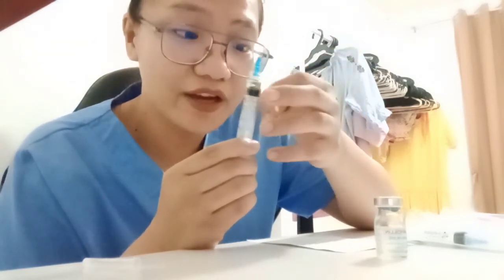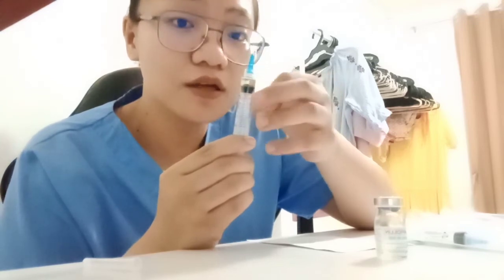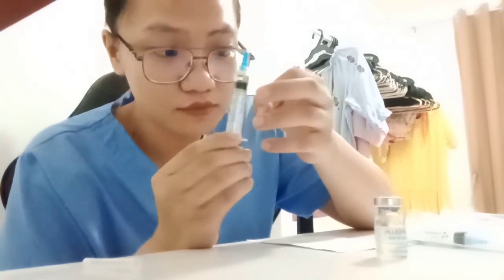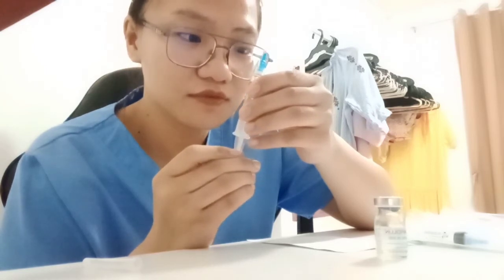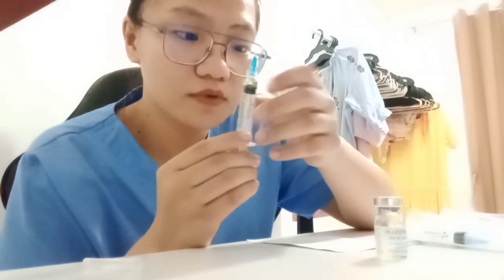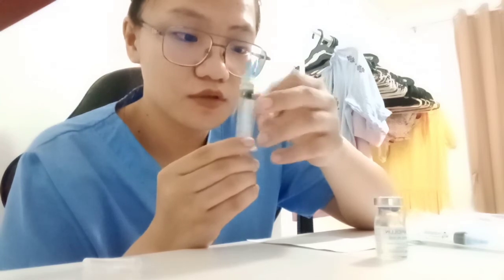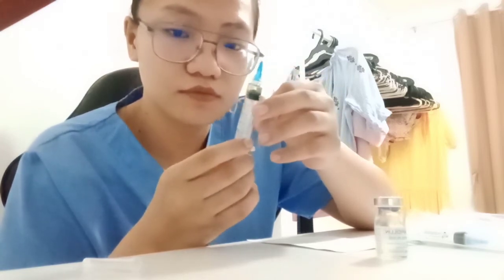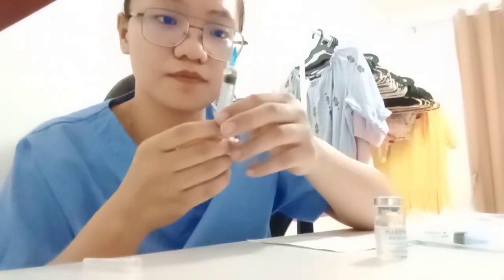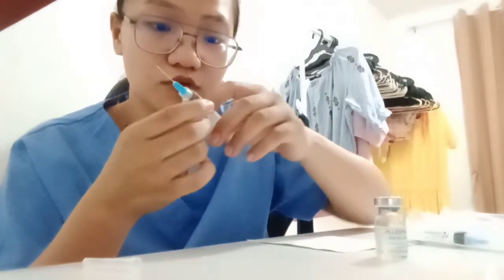If necessary, tap the syringe and pull the plunger to remove some air and bubbles. So that's it.